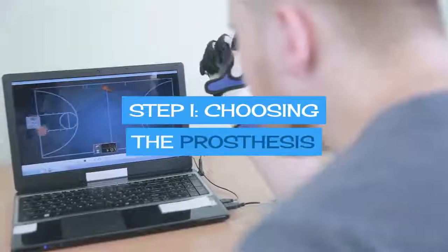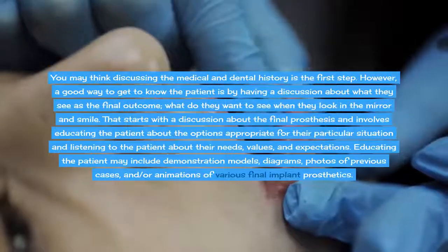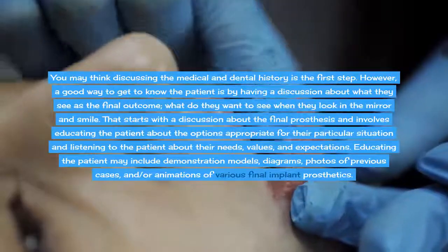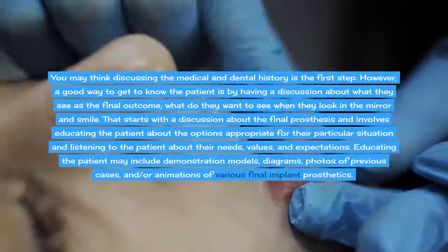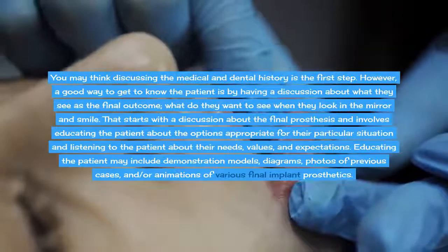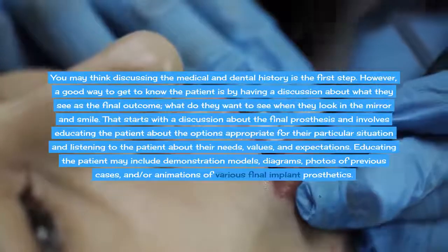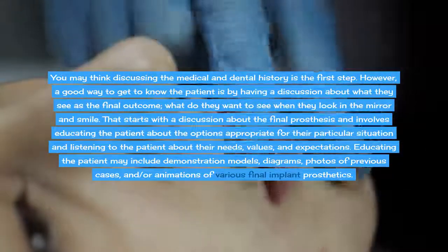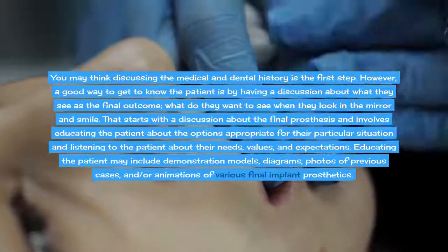Step 1. Choosing the prosthesis. You may think discussing the medical and dental history is the first step. However, a good way to get to know the patient is by having a discussion about what they see as the final outcome. What do they want to see when they look in the mirror and smile? That starts with a discussion about the final prosthesis and involves educating the patient about the options appropriate for their particular situation and listening to the patient about their needs, values, and expectations.